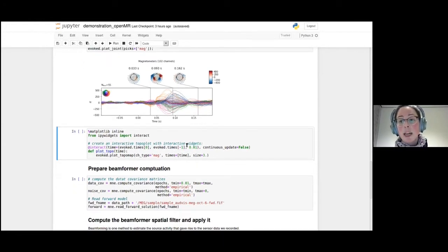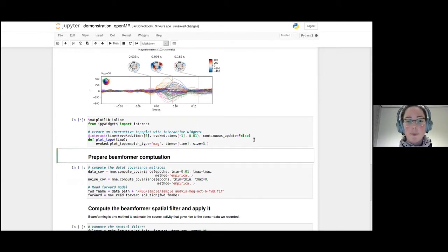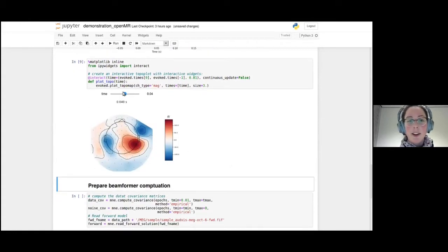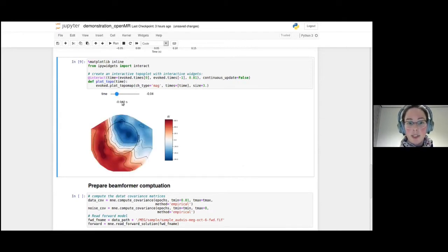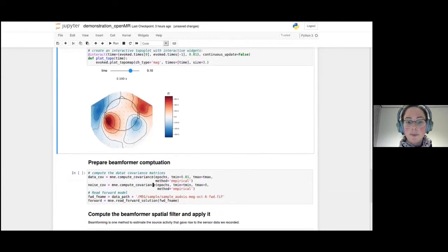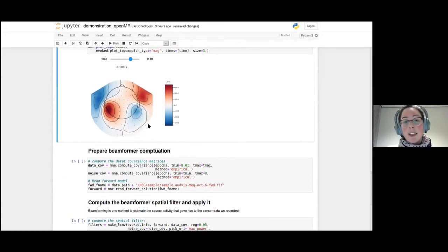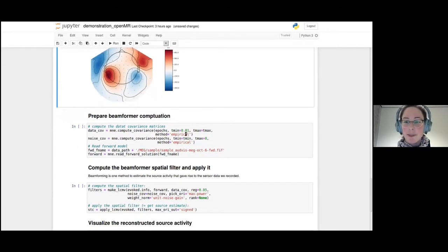Maybe we want to get an even better grip of what's happening in the topographic overview. For that, we can use IPython magic with ipywidgets to plot an interactive topoplot, where we can scroll through time and click around to see what's happening at different time points — for example, before anything was presented, or around 100 milliseconds where we have a lot of activity. This might already give us an idea where things come from in the brain, but I usually want to know more precisely where things arose.